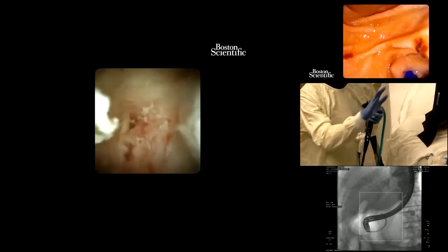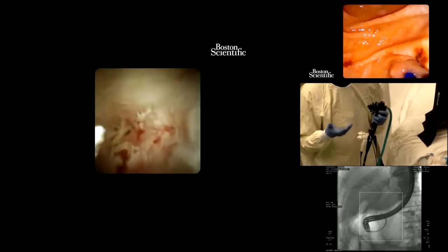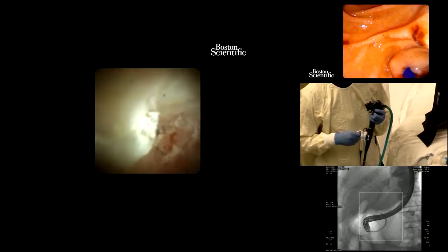So this is a good example of the image quality of the disposable endoscopes that we have. You have on your screen the disposable image, or a single use image, and then you also have the SpyGlass or the cholangioscope image. So they are quite comparable to commercially available reusable scopes. And so, Dr. V, we're going to show the ROSE that has been performed on the second pass. The specimen looks really nice, the second pass.